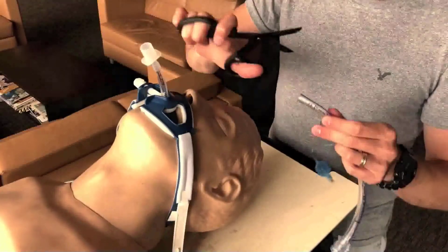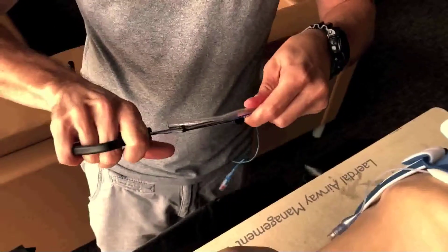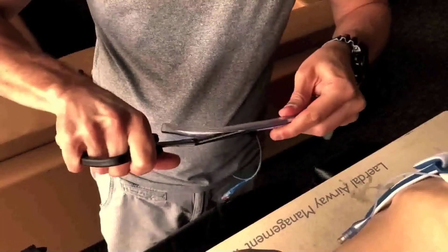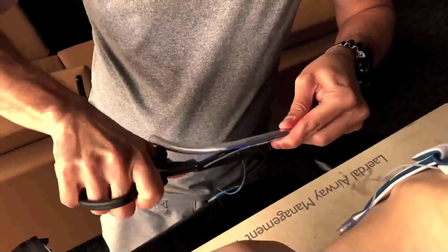We remove the cap, take our trauma shears, and we begin splicing the tube. This is something you can do before or after the procedure, though keep in mind it is going to be more difficult once the gastric tube is inside the endotracheal tube and you will more than likely need a smaller pair of scissors.